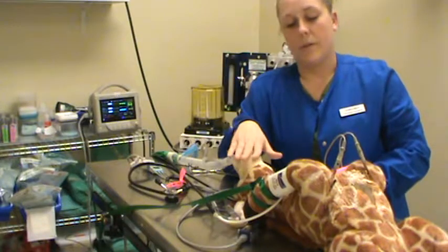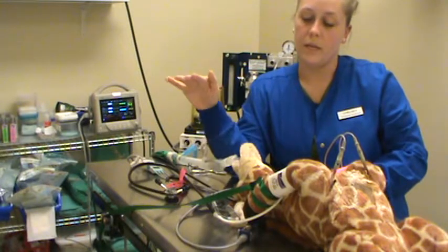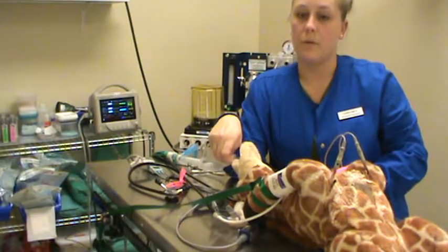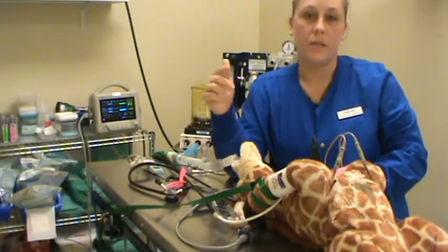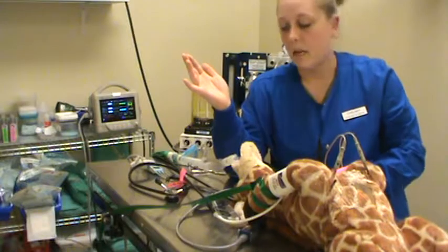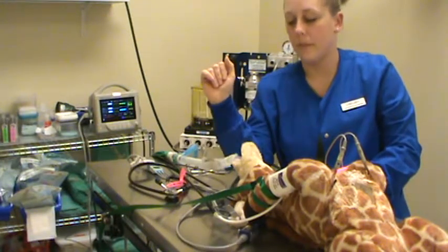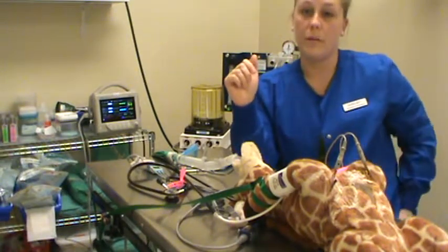The hallmark of stage 4 anesthetic death is we have asystole on the heart rate monitor, which is the flat line. We have a blood pressure that is either low or non-existent, and we have prolonged CRT, if any. So we might have really pale mucous membranes and a capillary refill time of 3, 4 seconds, if it's even measurable. Respiratory rate, we have none. We're apneic. We're breathing for them at this point, and they are on their way to Rainbow Bridge. So we don't want to reach that point. We want to catch anesthetic overdose before we get there.